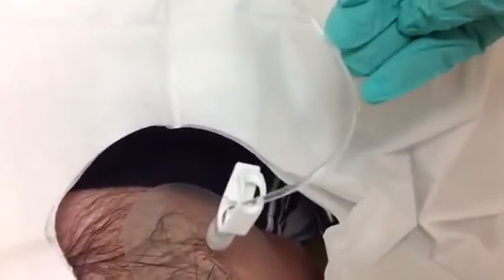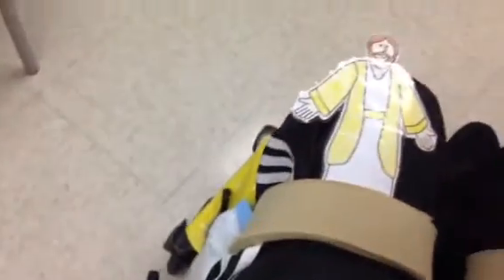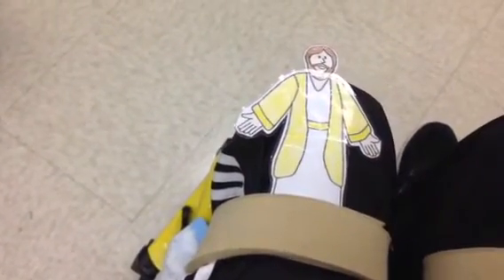This one's going to be just a little bit longer than the last one — I'm going to go, because I took a while to poke. Flat's still chilling. We should poke flat sometime, see if he likes it. All right, halfway full — let me grab the other one. He's used to that.